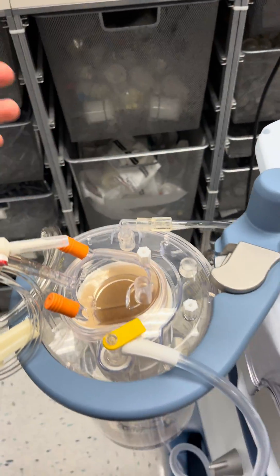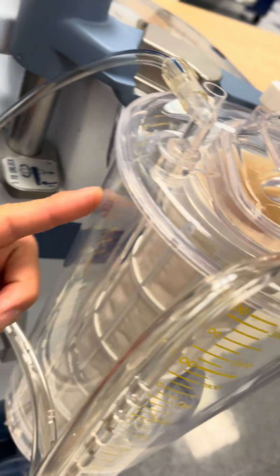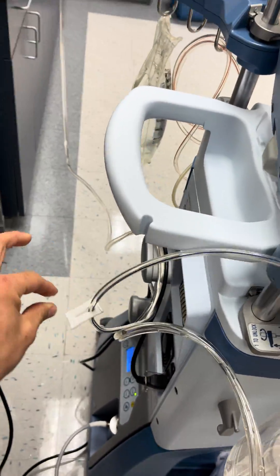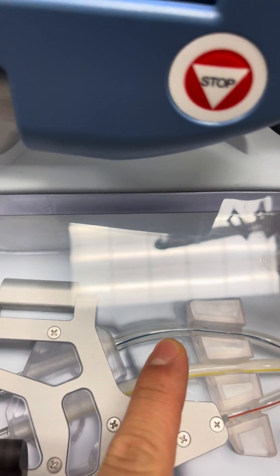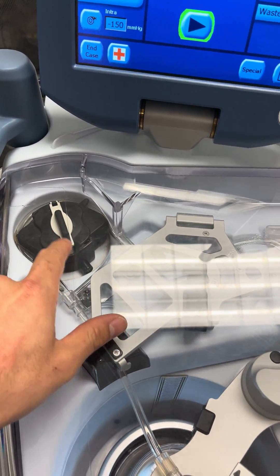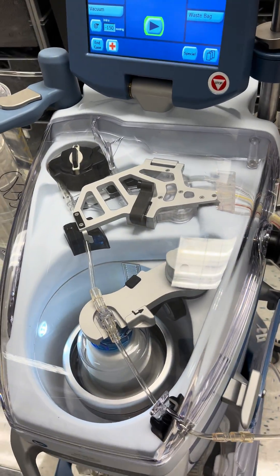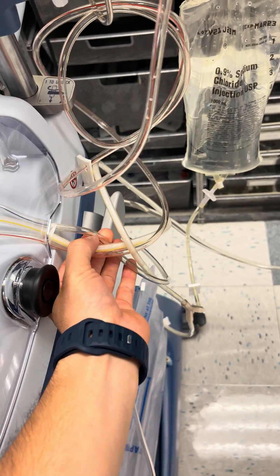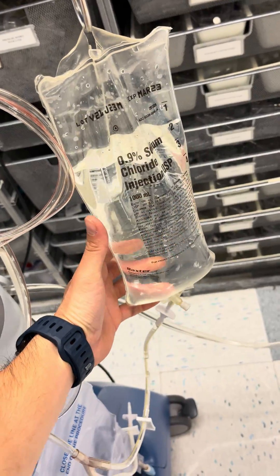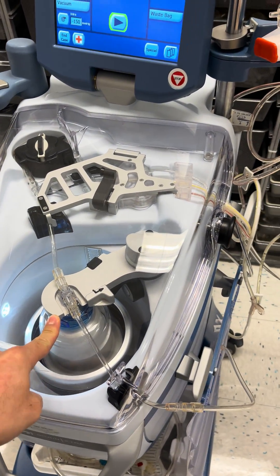To get blood from the reservoir into the Cell Saver, there's this line with a straw that goes down into the fluid. The blue line here runs around the Cell Saver and enters it — the Cell Saver uses a roller pump mechanism to bring fluid from the reservoir into the centrifuge. The yellow line is the wash line: you'd spike a bag of saline with it, and that's what gets used to wash the blood in the bowl.